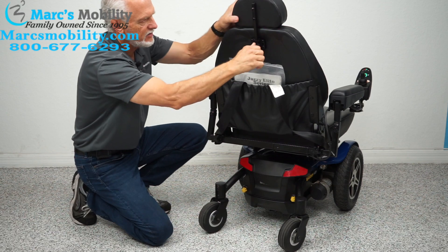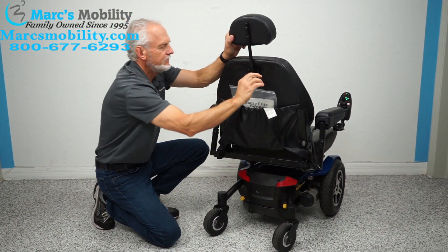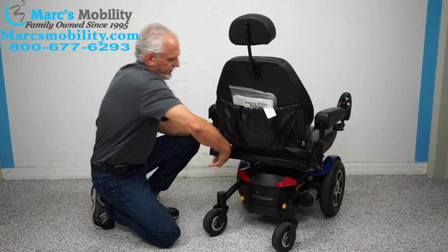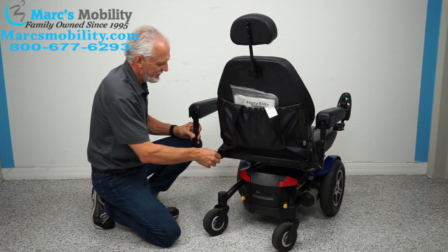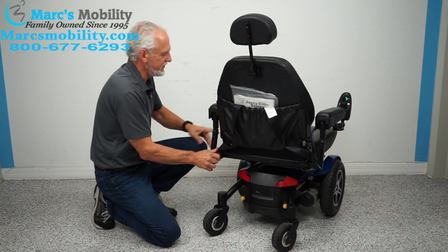You have an adjustable headrest, as you can see here. The arms are also adjustable — you can move them out as far as needed. I like to keep them tight to the seat so you can go through a door a lot easier.